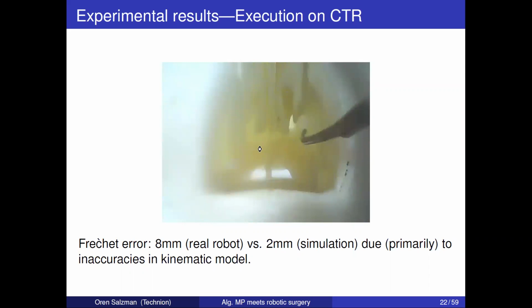give guarantees. What we can say is that the motors of the system don't work at finer scales. The surgeon doesn't care anymore how far away I am from the distance. So there is this minimal resolution, and underneath that everything is noise. And if we're above that, then if a plan adheres to this minimal resolution, then we can find a solution. So we can actually have these values, and these are on the order of millimeters.